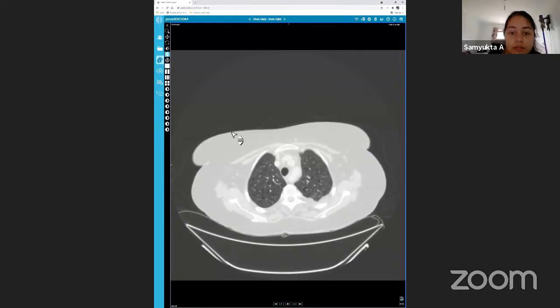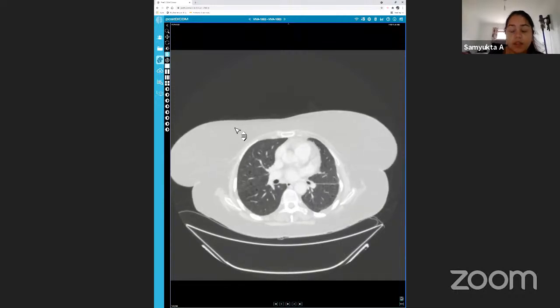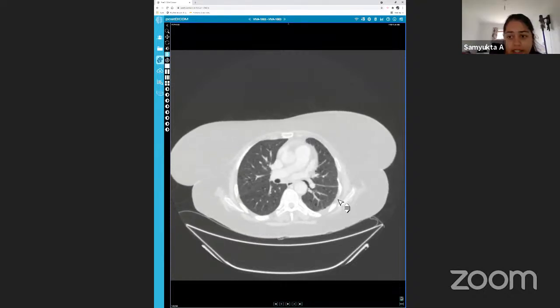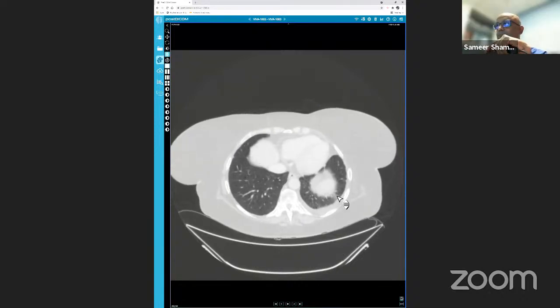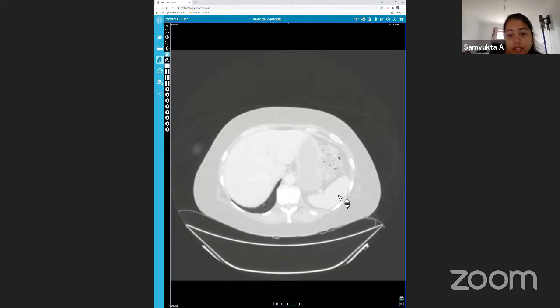So in terms of cystic lung disease in a female with the effusion, I think I would look at it more in soft tissue windows, but I think this is most in keeping with lymphangioleiomyomatosis. I would look at the base of the scan in soft tissue windows to look at the kidneys if they are included for something like tuberous sclerosis, where they get angiomyolipomas, and I'll correlate with the history and any brain imaging that's on the system.